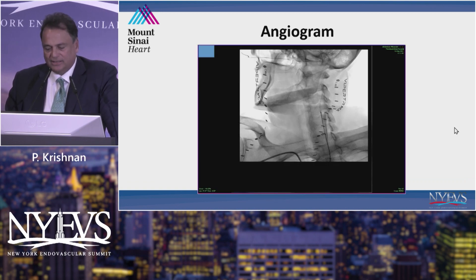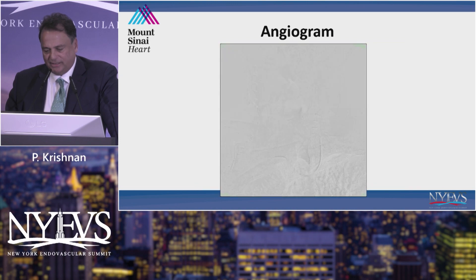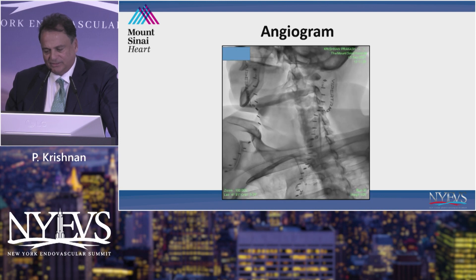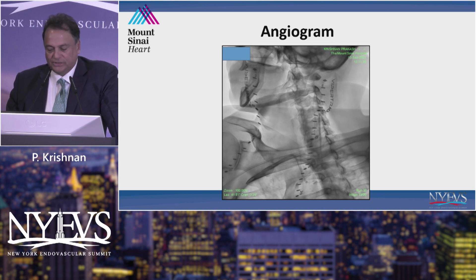You can see dye staining here. The patient was quite stable. We said let's place the stent — here's another self-expanding stent going in. As we placed the stent, you can see there's still a little proximal lesion causing no flow. So we went ahead and placed another stent. And as we did that, we lost everything — everything fell out of the carotid, including our sheath, with the exception of our wire up north.